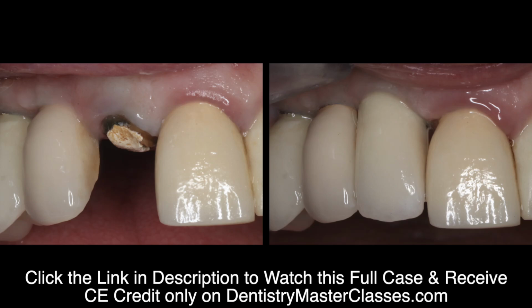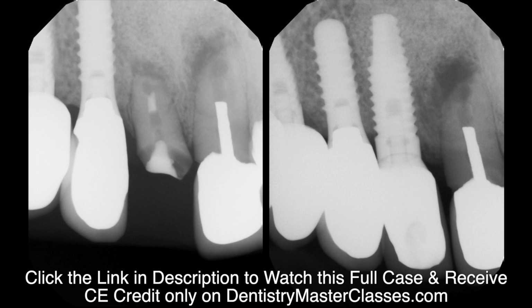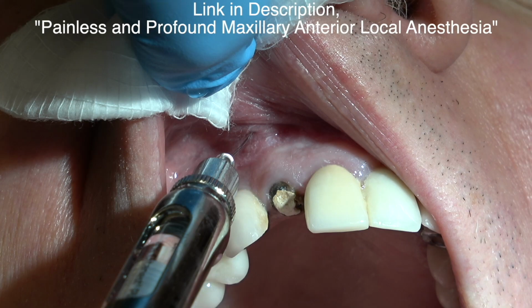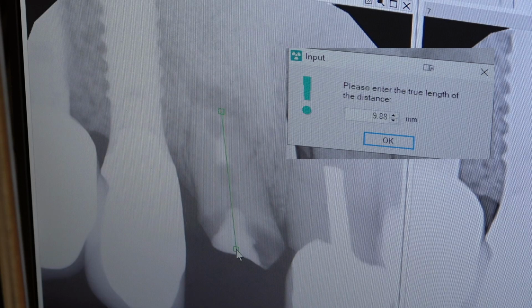This is not an aesthetic case. This is the tooth that had fractured vertically. You can see that tooth had endodontics, an apicoectomy, and a cast post. Today, we're extracting that tooth with the Easy Extract, number 7.